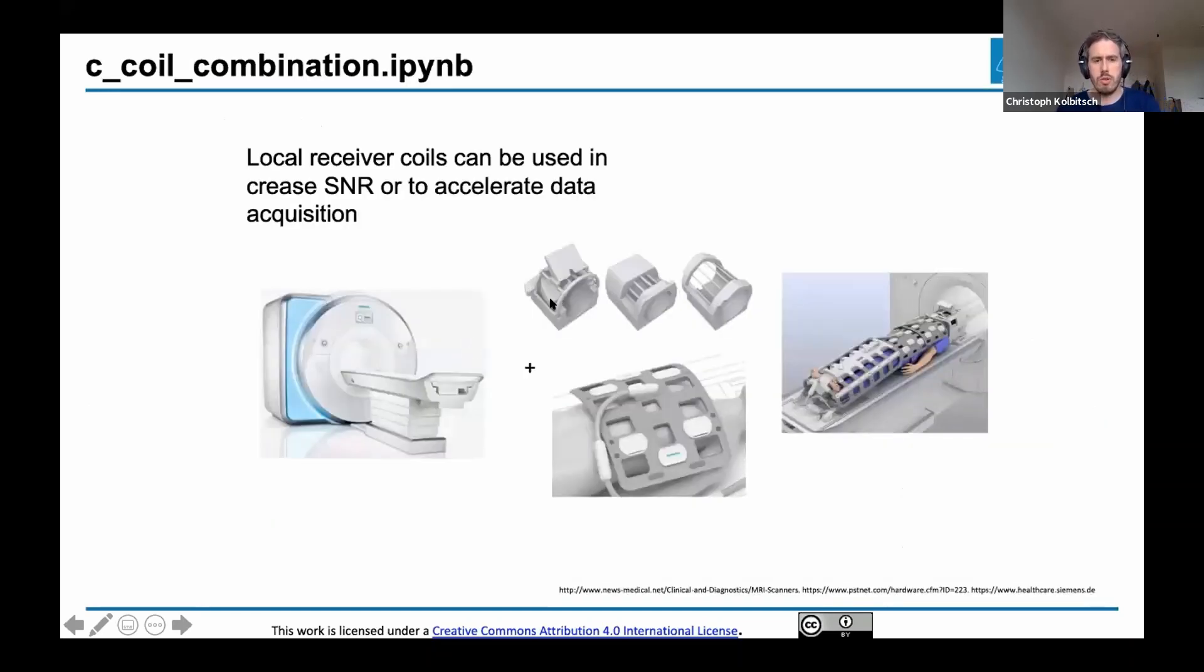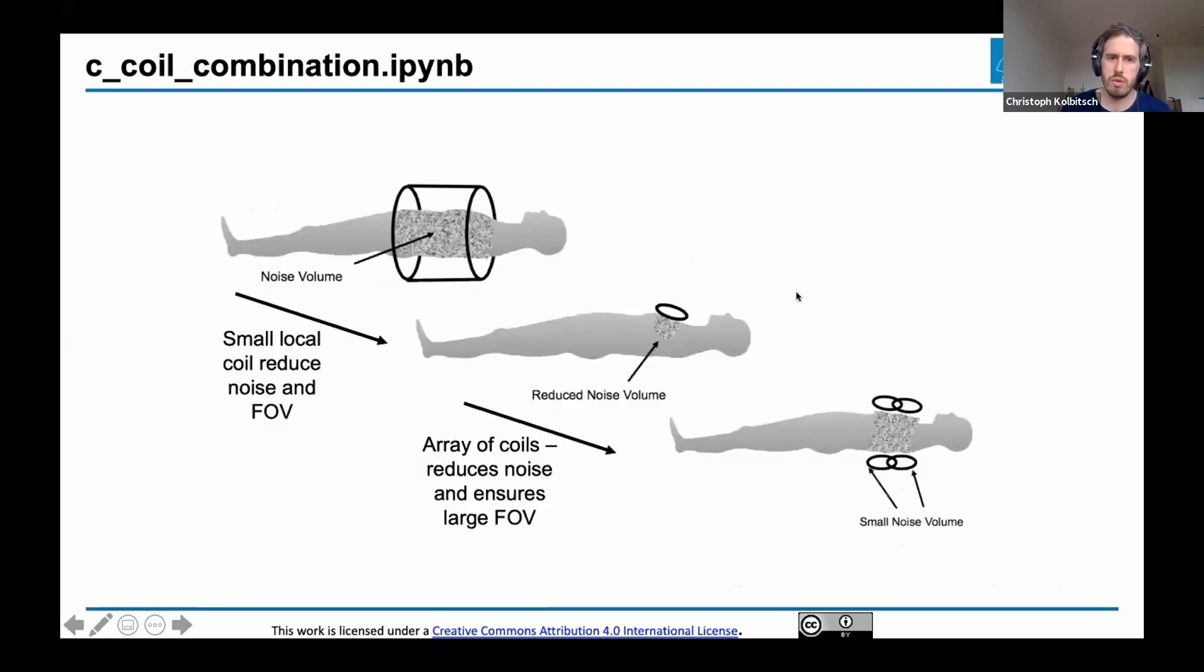Coming back to the coil combination notebook, the MRI scanner uses B0 to create our signal and code it spatially, then uses additional receiver coils to receive the signal. The main reason this was developed is to improve SNR. Here's an example of a big coil which covers everything we want to image, but everything visible by this coil can produce noise, which isn't good if we only want to acquire a small slice.